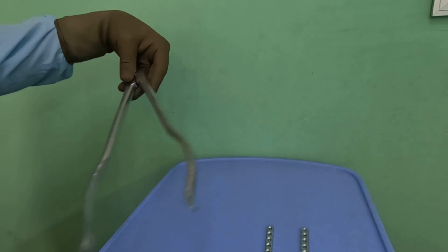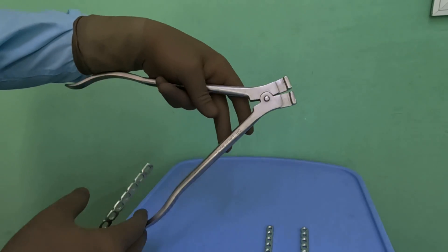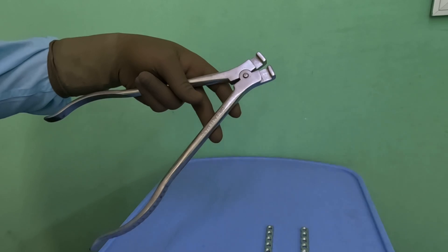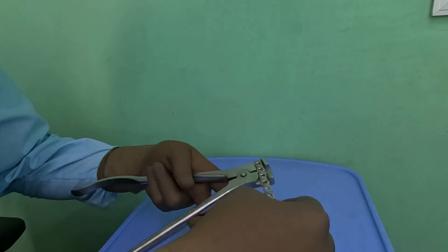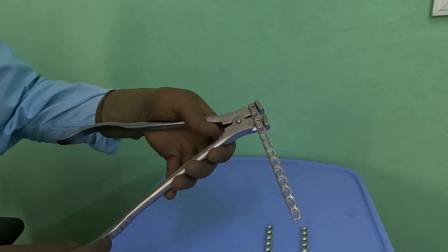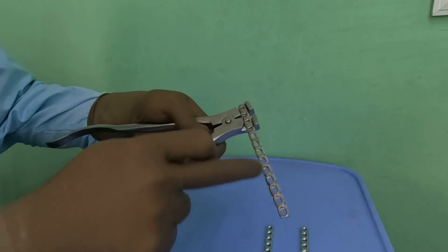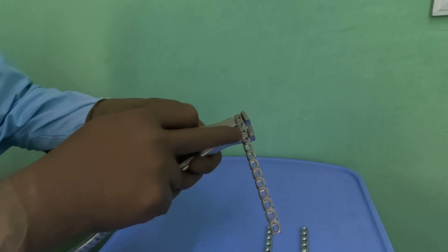Let us take the anterior plate and show you how we normally do the bending. This is the side bender or C bender — a very simple one. You also have more sophisticated ones which offer side bending as well as bending in different directions. We hold the plate at the edge where you want to start bending, typically at the anterior part where the pubic bone starts. The simple rule is that these plates are invariably J plates.